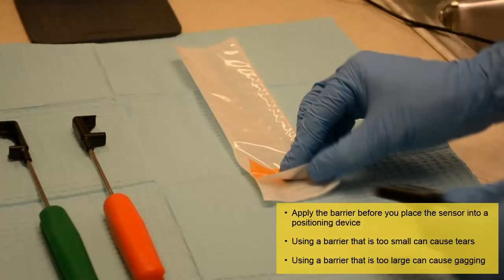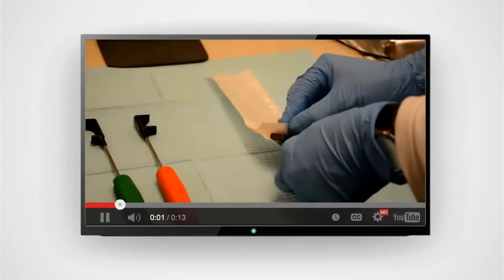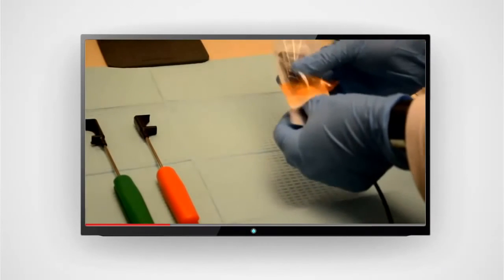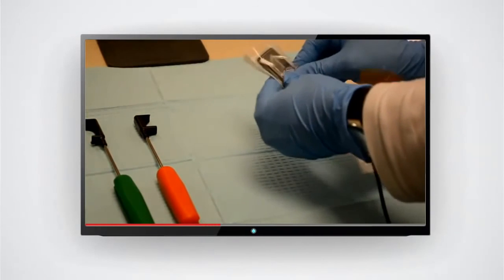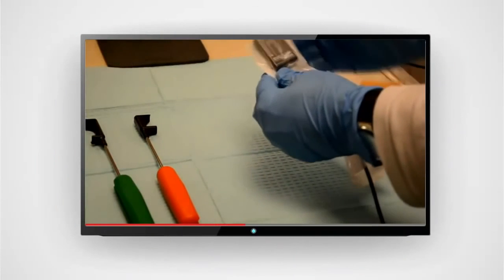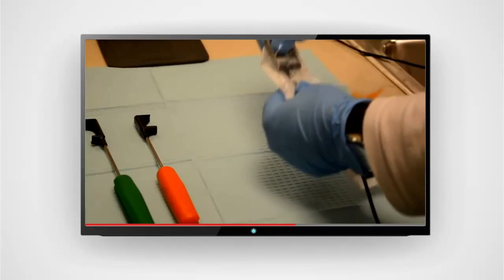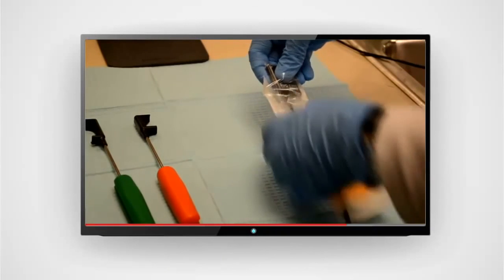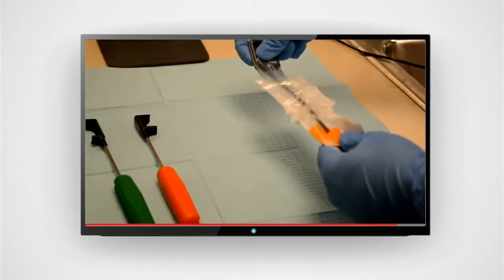Quick tip: using a finger cot on top of the barrier can help prevent tears during the x-ray exam. After you select the barrier, slide the sensor into the barrier. Make sure that the barrier slides all the way down on the sensor. If necessary, use your thumbs and four fingers to push the sensor to the end of the barrier.